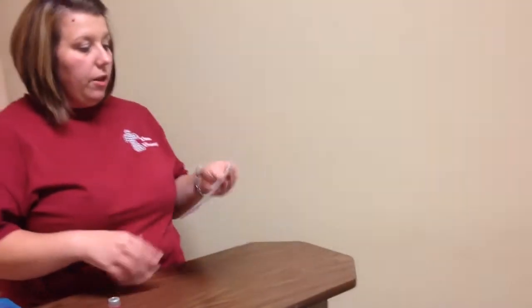Students, now I'm going to talk you through giving an IV push medication. So the first thing you need to do, again, is verify your physician's order. So I'm going to look to see if I have a physician's order.